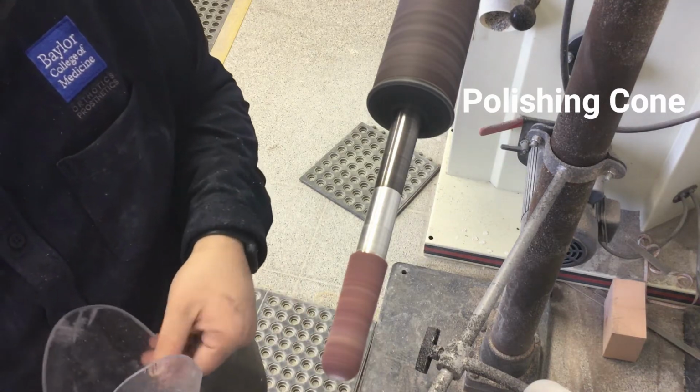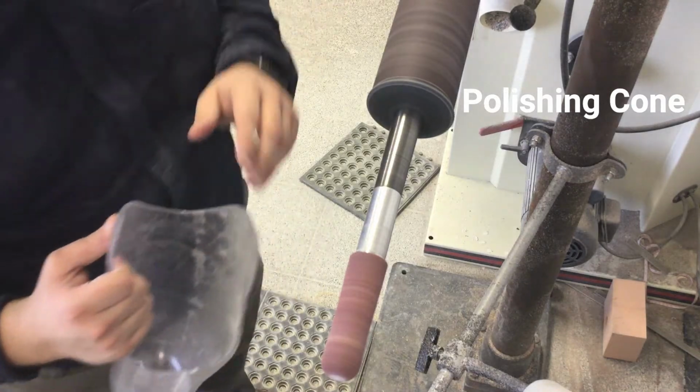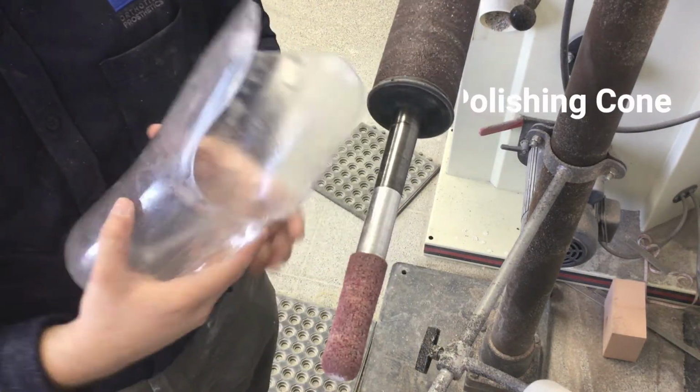Finally, clean out the socket with any cleaning agent that your lab facility normally uses.